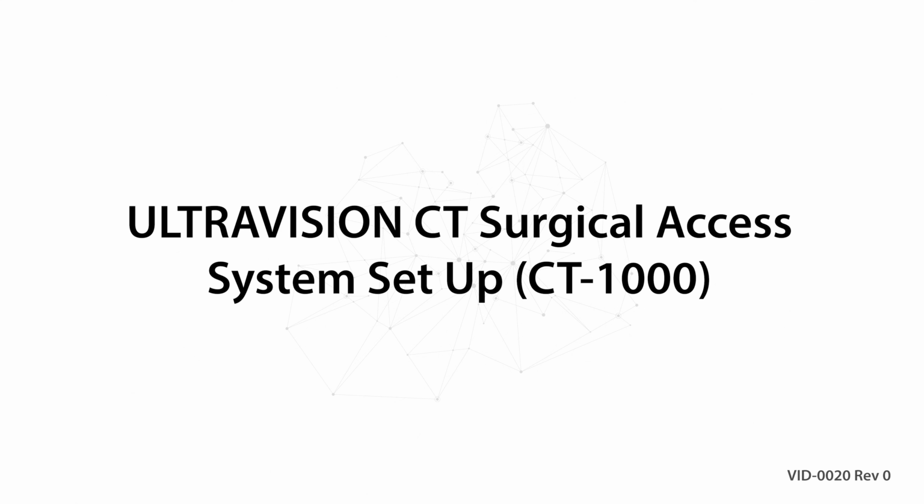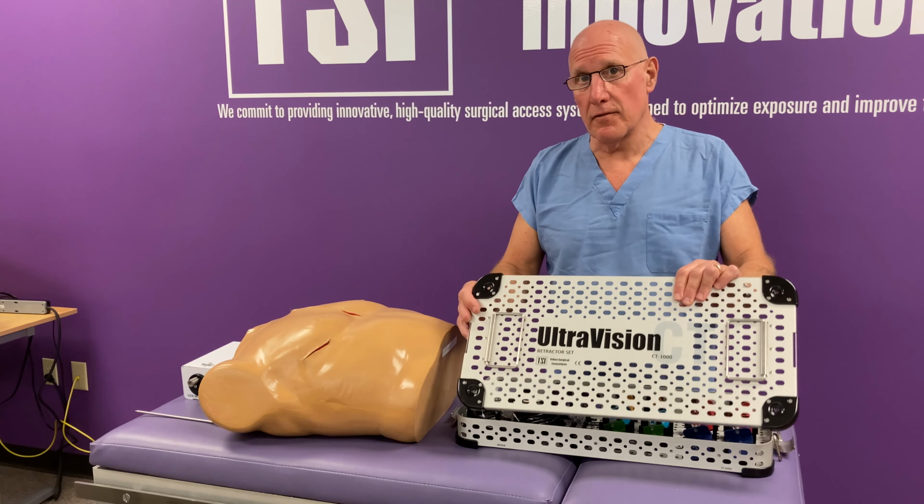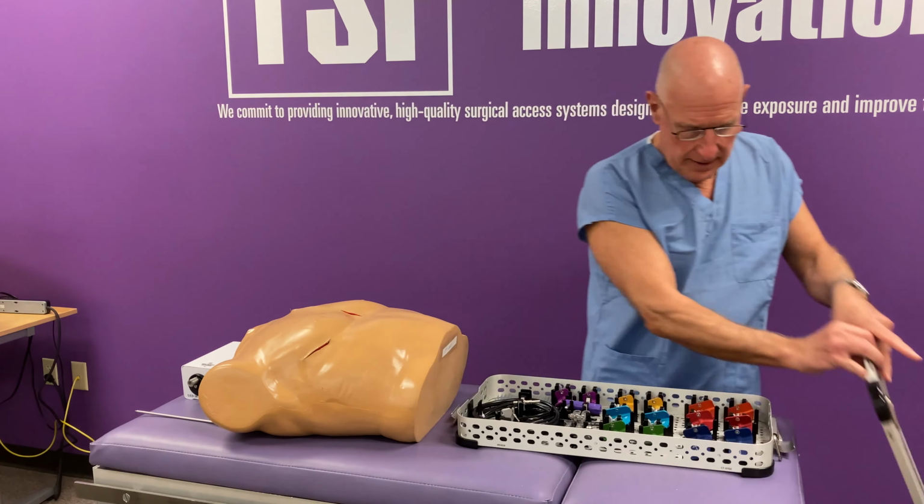This is the ULTRAVISION CT surgical access system for optimal, minimally invasive thoracic access. This system comes with a wide selection of retractor blades so that it can be used for all patient sizes and all incision sizes. Of course, minimally invasive incision sizes. Comes with a light cable and the retractor body and the pivot tool to control the pivoting blade function.